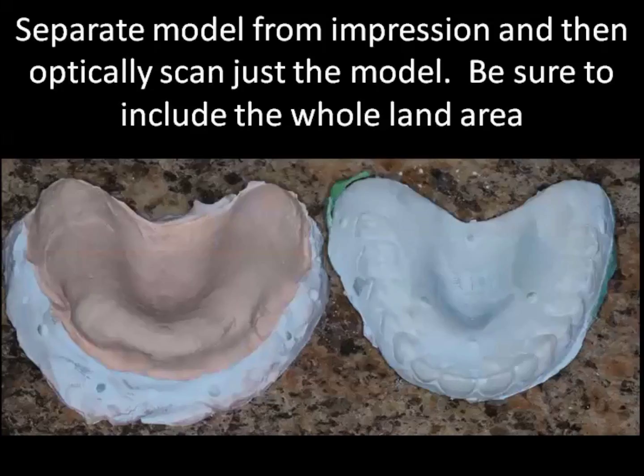Once you've separated the denture, you're going to create another optical model — this time just of the cast. It has the tissue surface here, and we're going to make sure that we fully pick up all the markers that are in the land area once again.